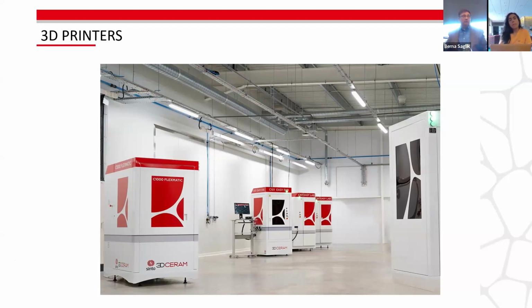And then we have a C3600 size printer, which is 600 by 600 by 300. So you could do an immense build platform for mass production. We do intend for this to be used at the university level, let people learn how to use this equipment, and then scale it up for mass production. And that is the goal. Mass production, feasible means with just gradually growing the scale of the production. So that's a little bit about what this technique is and how it's used.